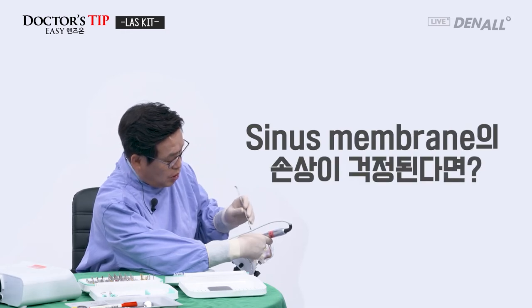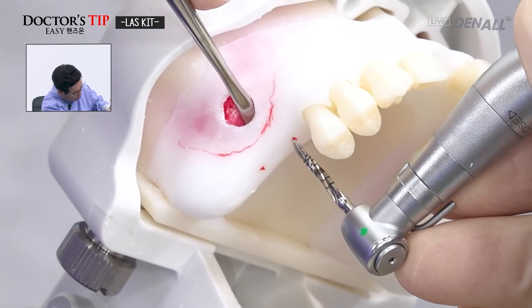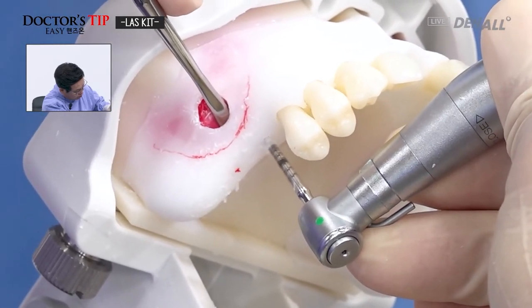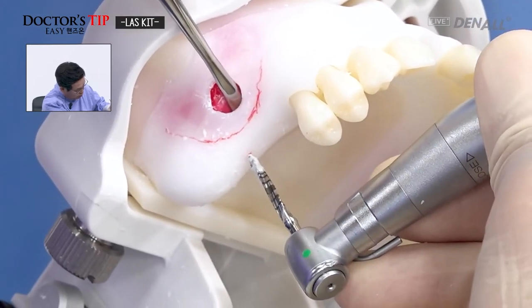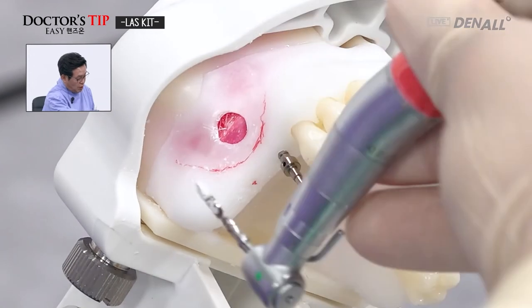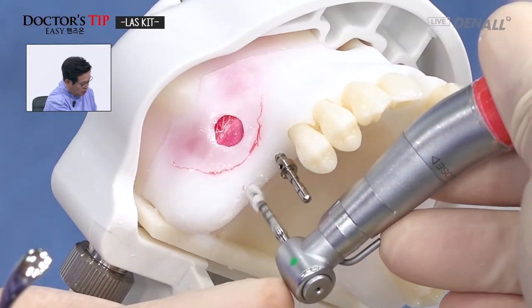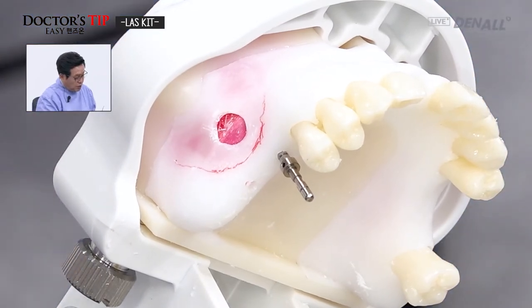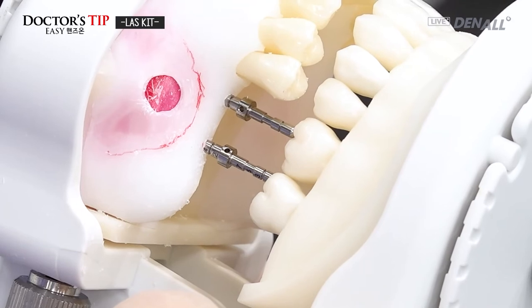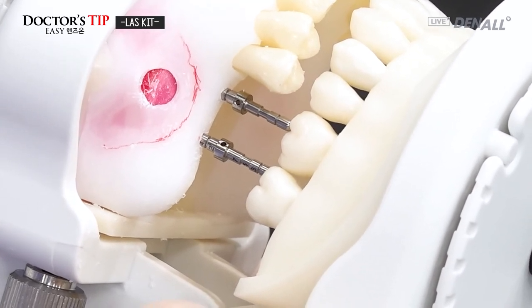So if you're worried about hurting or tearing the sinus membrane, then in the clinical setting, you don't have to fully open it like this, but you protect and then mark the drill hole area. And then the parallel pin will be put on, then number 17, like this, we mark the drilling site, then again the parallel pin is used to check the drilling position, and you check the occlusion, and as you can see, the functional cusp on the lower side, the drilling path can be confirmed.